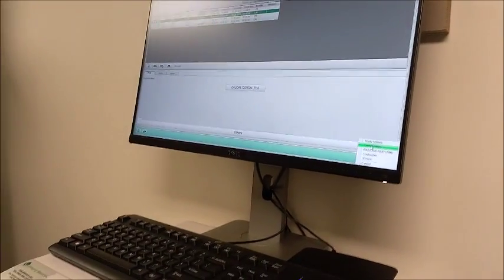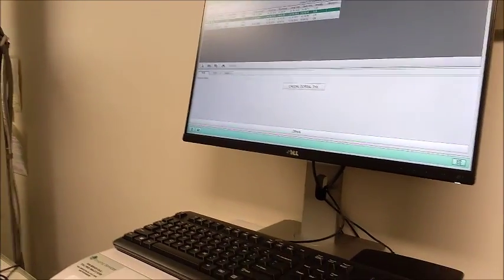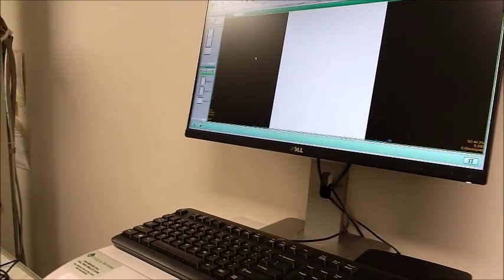In fact, you won't need to use any of these utilities. That's all just stuff that we use. Okay. And now the backup is automatic? We don't have to do something nightly or?